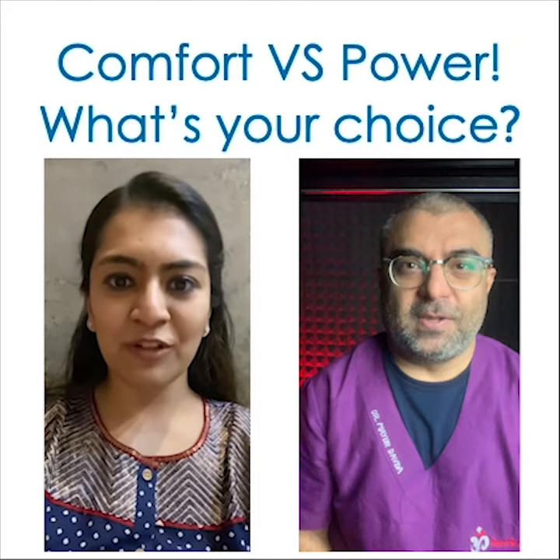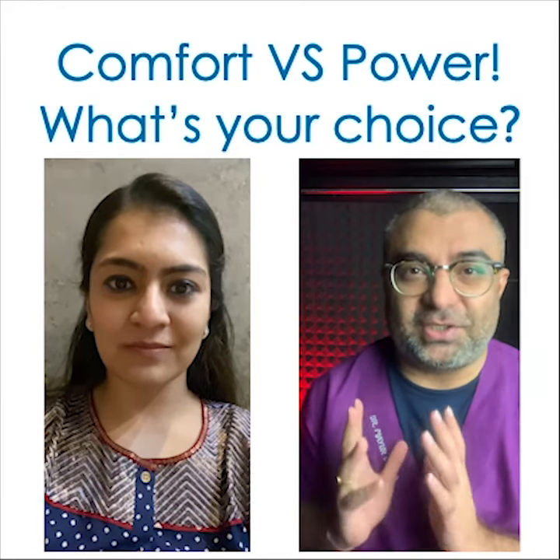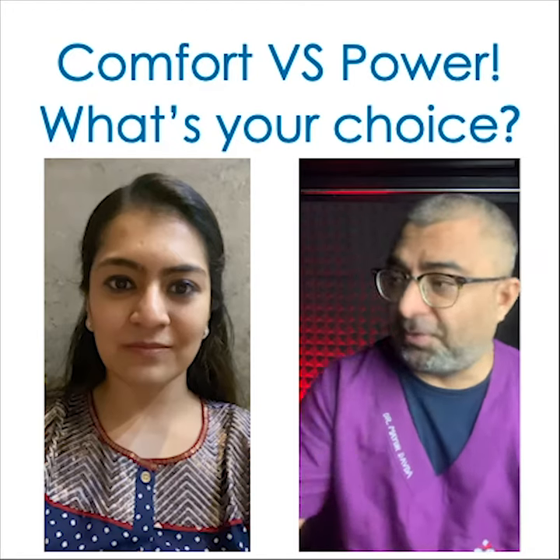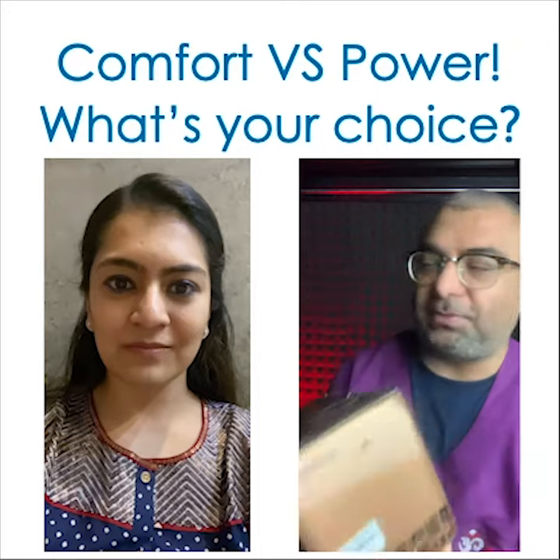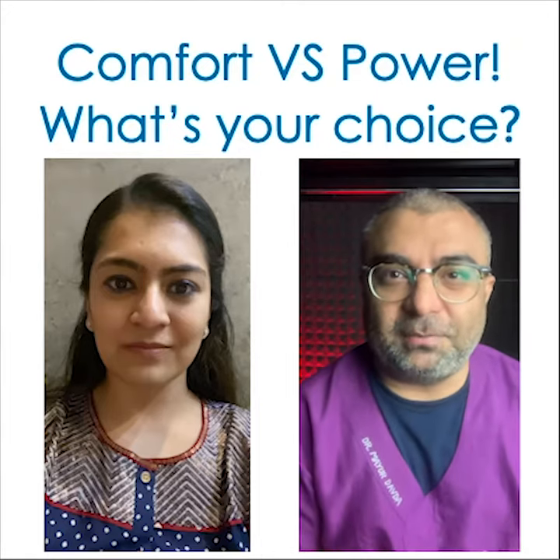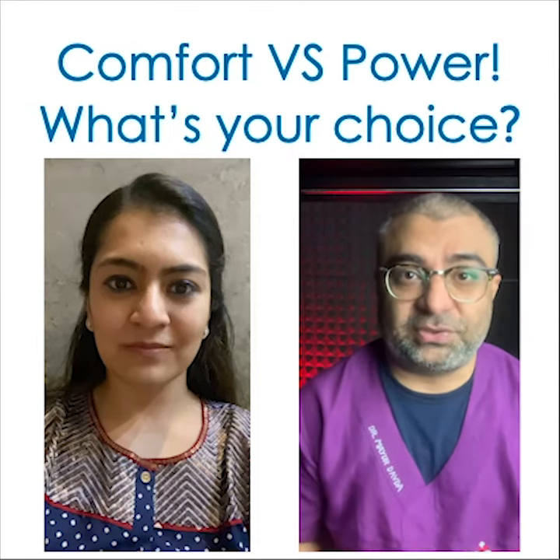So which ring flash should be preferred for dental purposes and why? That's a great question, Shikha. You're right — guide number is equal to distance from the flash multiplied by the F number. The older one did have a guide number of 14, which was similar to that of the Canon, but very honestly, even though the guide number was 14, when I compared it with the Canon ring flash, the power was comparatively lesser.